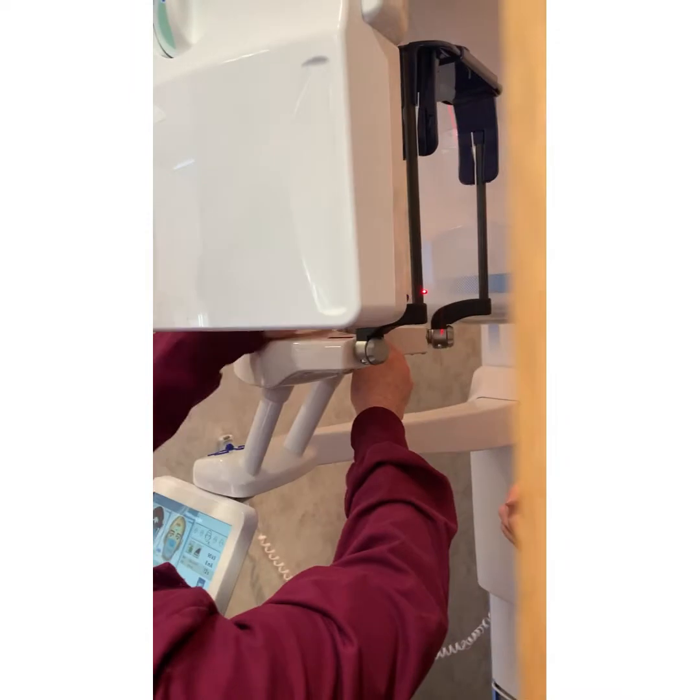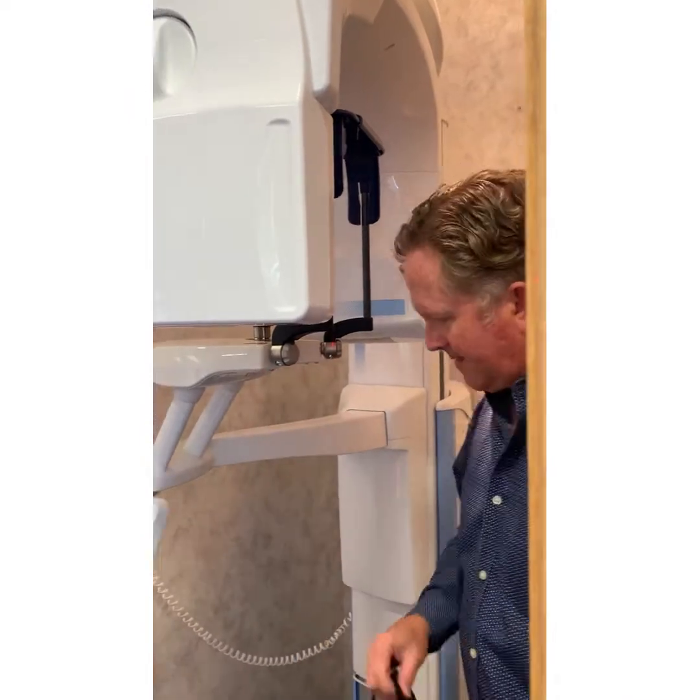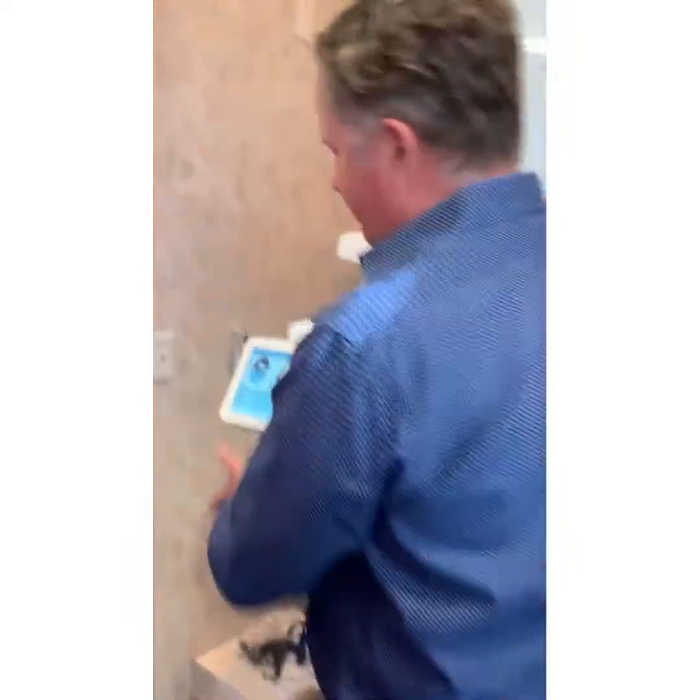Somebody's a little pissed off at it. It's just on a spring, and there are four notches in there, so you can adjust it. It's going to do it a couple of times. He'll get it. So once you've got them lined up, once you've got them good, then you're going to hit the scout button to get a scout.